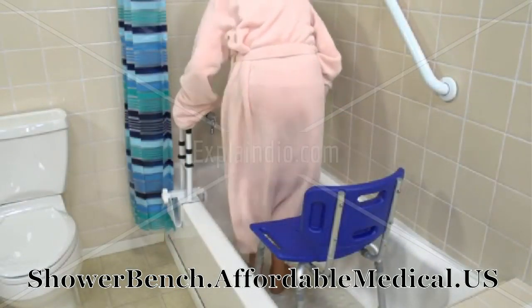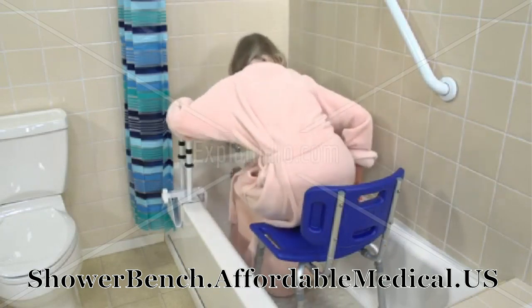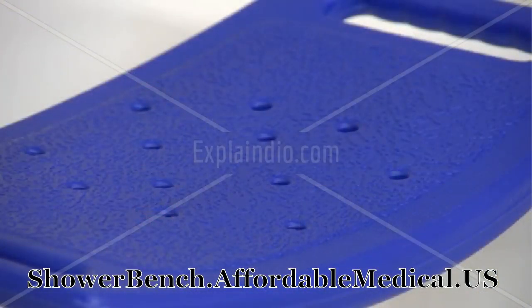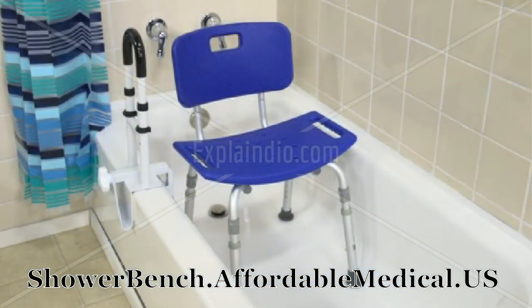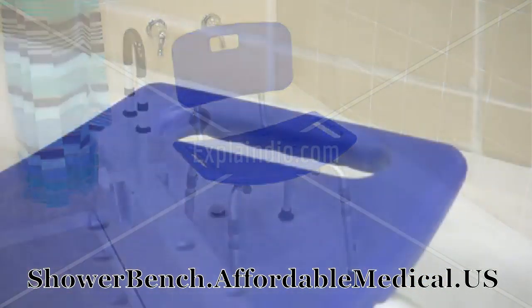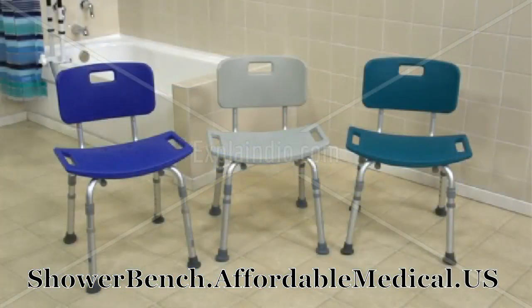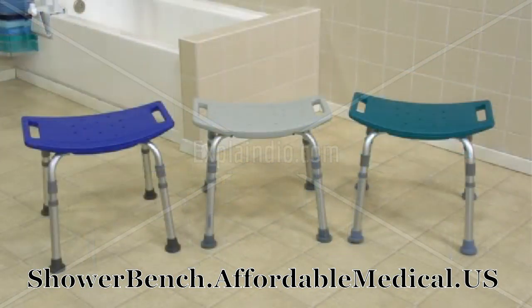This lightweight aluminum frame is corrosion proof and strong enough to support up to 400 pounds, and these drainage holes reduce slippage. The contoured seat provides maximum comfort, has handles for added security, and is easy to clean. It is available in three color options, with and without backs.